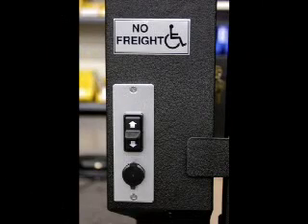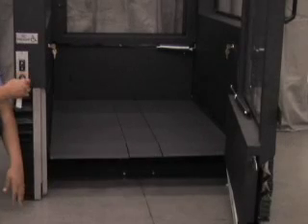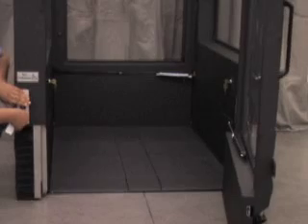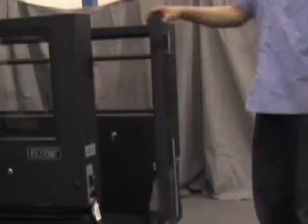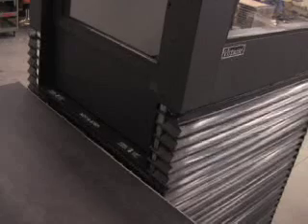Press an operating switch down while turning the override key clockwise to lower the lift car to the floor. Be sure to stay clear of the edge of the lift car floor while lowering the lift car. Move the height adjustment knob to the maximum height position, 60 inches, and then tighten it. Reposition the hold open washer on the door closer on the lower landing gate and close the gate. Use the lift car operating station to move the lift car to the upper landing height.